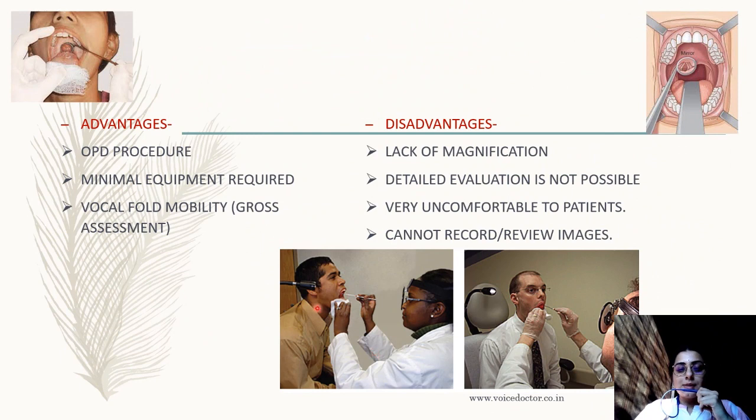So this is the exact position. The patient is sitting in front of you in a panting position, like with the tongue out. With one hand you're holding, and with the other hand you're inserting the mirror. So this procedure has certain advantages and disadvantages.